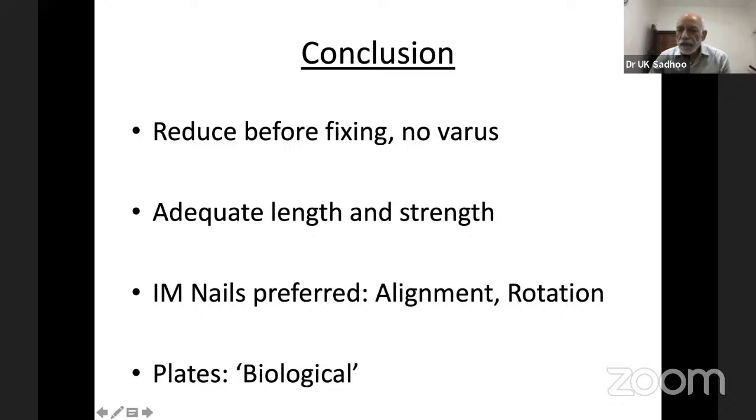Let me start again with the AP view. You have to aim either for the center or preferably for the infero-medial part of the neck and the head. Now, even if you have a previous DHS, the infero-medial part would still be virgin. So you would still not lose the hold. So aim for your guide wire that goes before you start the chisel; that gives you a damn good idea where the chisel might go, because that literally is to show where the chisel should go.